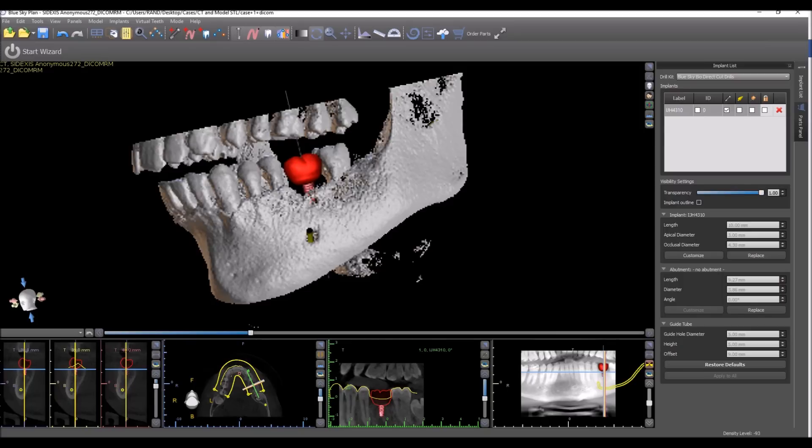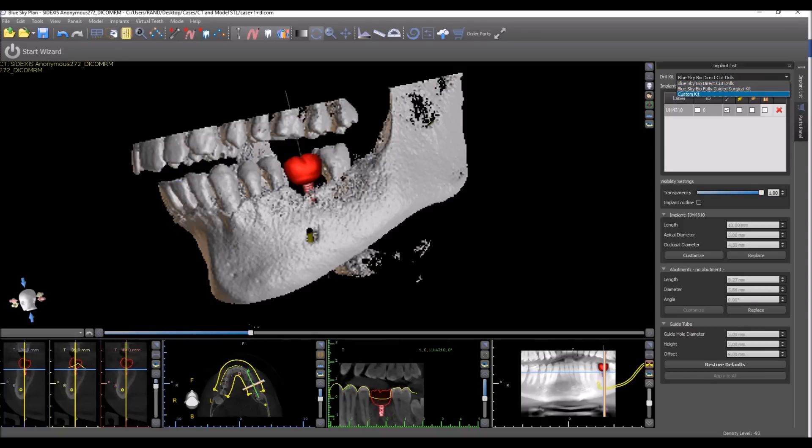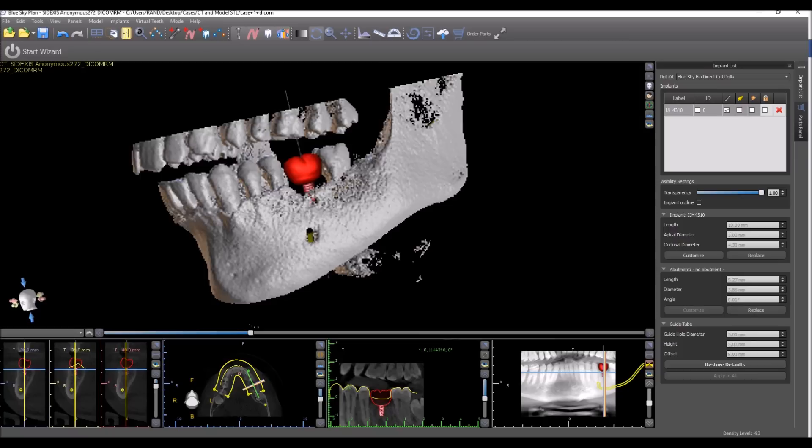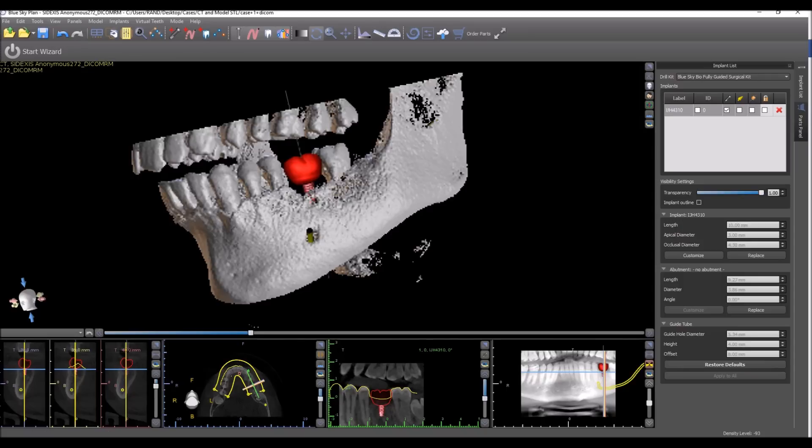You can see that in the implant list, there's now a new drop down for drill kits. Here you could select if you're using the direct cut drills, the fully guided kit, or if you're using another kit. And in the future, we're going to have additional kits listed here as well. And you can see, watch right now, we have direct cut drills selected and look at the values in the guide hole diameter, height, and offset. Now if we make the change to the fully guided surgical kit, we can see how the data and information updates automatically.